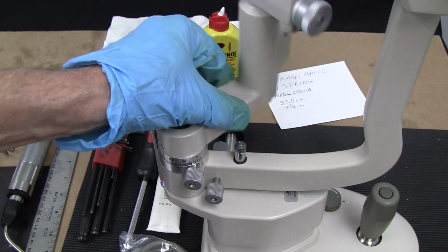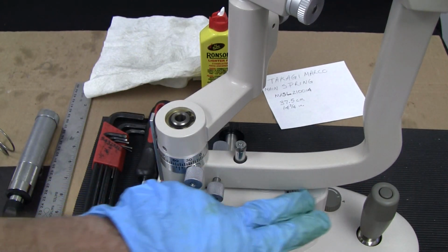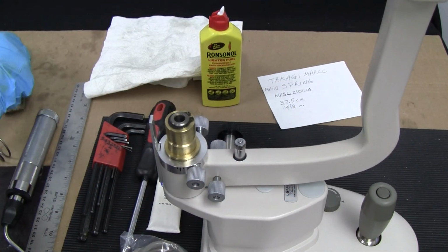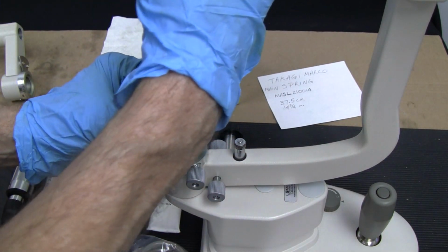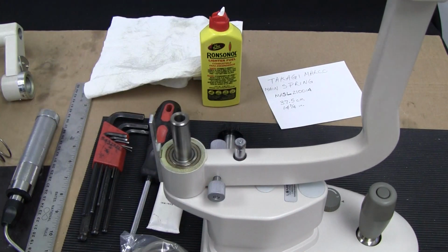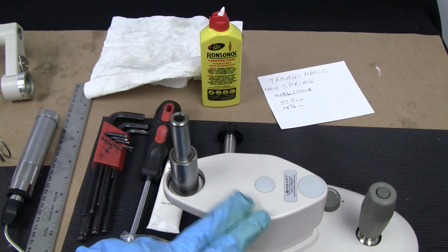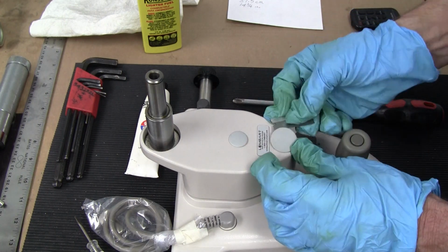You need to take the tower assembly off and the arm to take some of the weight off of this lift arm. You'll need a 2.5 millimeter Allen wrench and your snap ring pliers. Now that we've gotten a lot of weight off of this lift arm, we're going to take these two caps off.